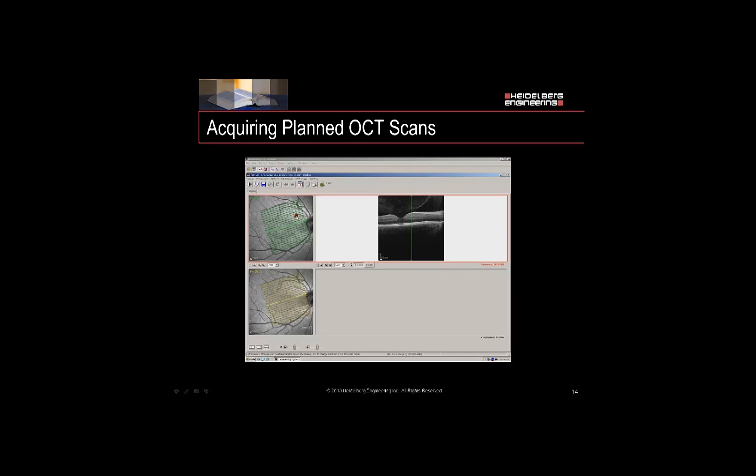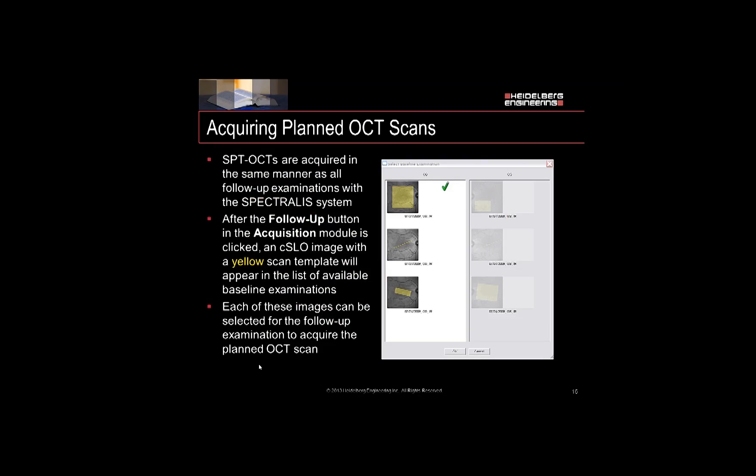Let's review acquiring a planned OCT scan. Planned scans are acquired in the same manner as all follow-up examinations in the Spectralis system. Scans will show up in the follow-up menu, color-coded yellow so you know the difference. Multiple scans can be acquired in a single setting.